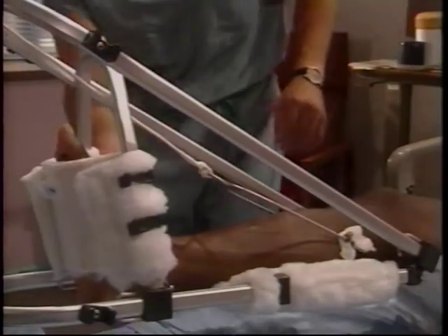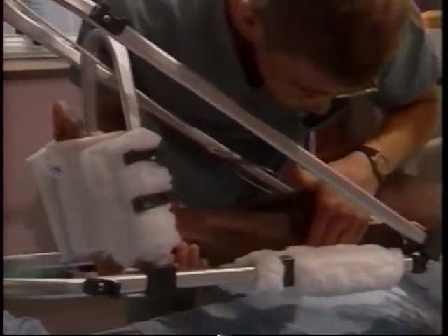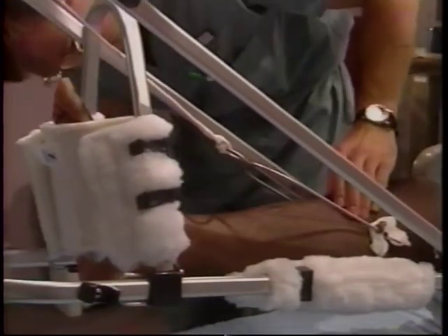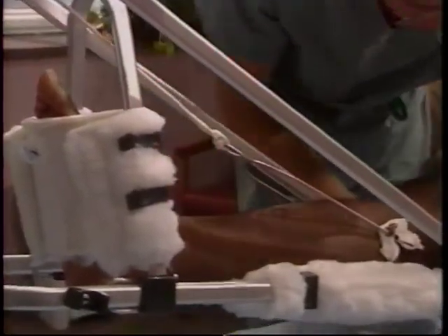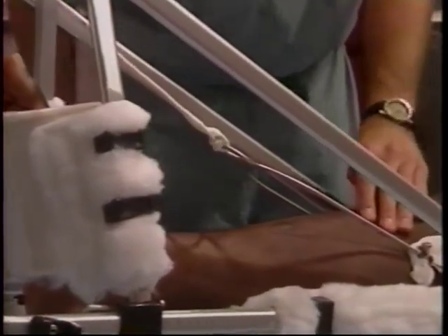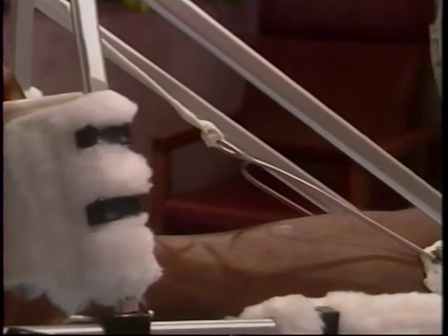Check the skin that is covered by or attached to the traction apparatus. These areas should be monitored very carefully for signs of irritation or pressure. Inspect any scarred areas or open lacerations for redness, irritation, or infection.